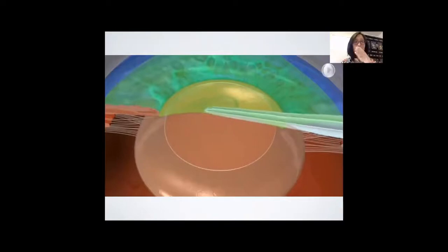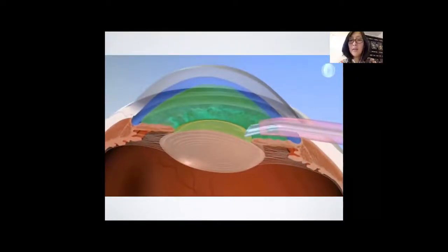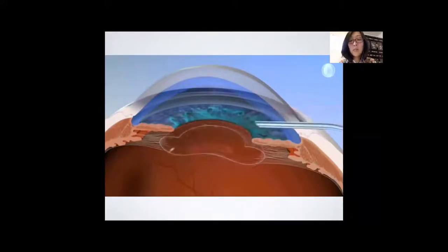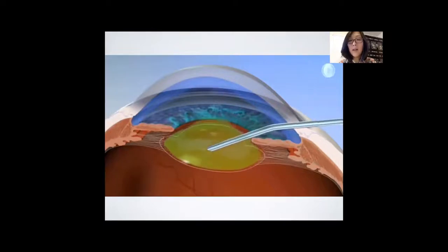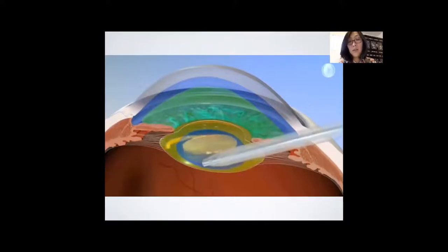And I like the way that the cohesive presses down on the anterior capsule in order to perform the capsulorhexis. And you can see here during phacoemulsification, a lot of the viscoelastic is actually aspirated. But when you have a nice coating of the dispersive, that really protects your endothelium. I use a cohesive to then go ahead and inject the implant.